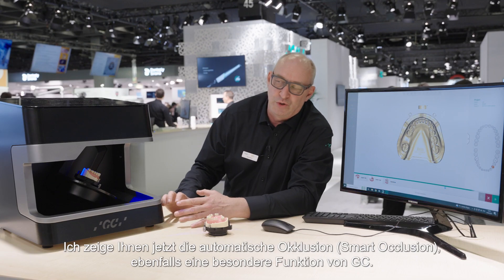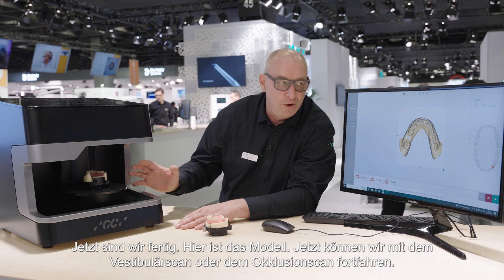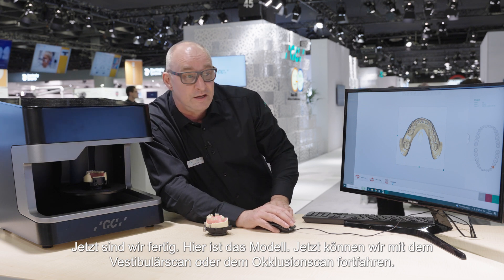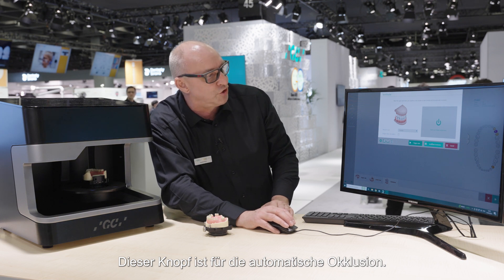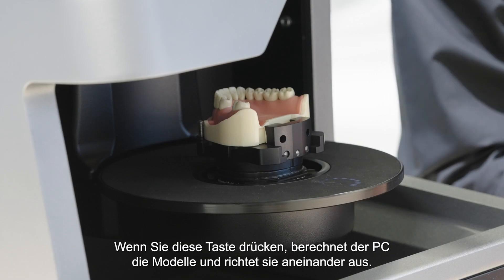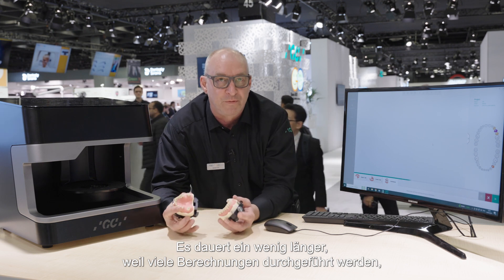I will show you the automatic occlusion — that's also a part of GC's unique things. Now we are finished. You see here the model and then I want to go to the vestibular scan. After that, here is the button to press for automatic occlusion. If you do it, the PC will calculate the models and will match them together. You will get a result which is the same as if you scanned both models.